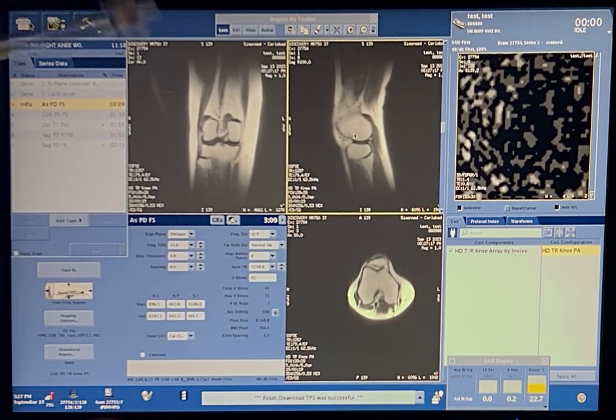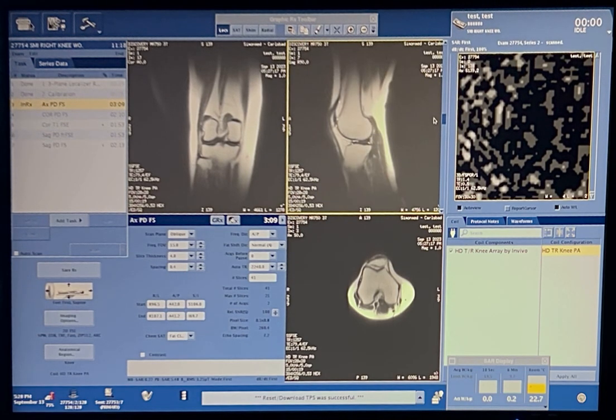Okay, so that money slice, let's find, I like to angle with the tibia. Go up 2. Oh, okay, yeah. Alright, that's it. Yep. Alright, and then this one.